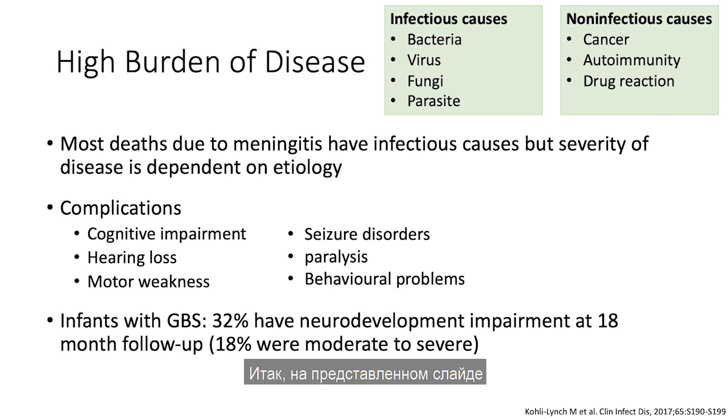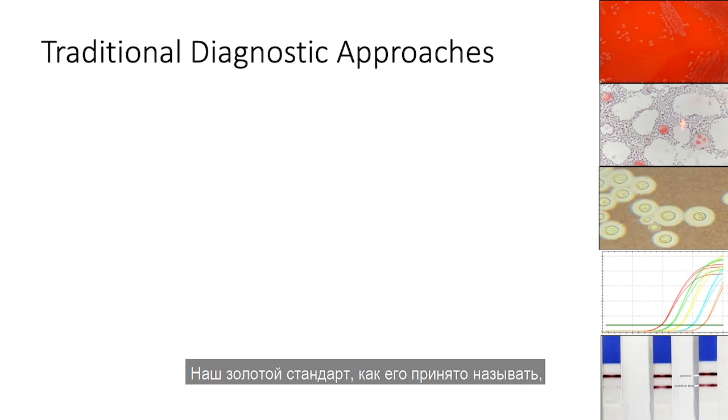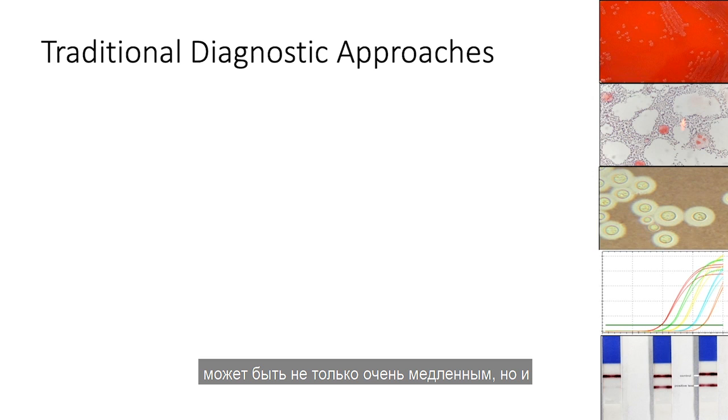The image here just demonstrates some of the different types of workup that's typically done in the laboratory. Our gold standard, or really the imperfect gold standard, is culture, which can be very slow, but also very insensitive, especially in patients that have been treated with antibiotics prior to lumbar puncture.